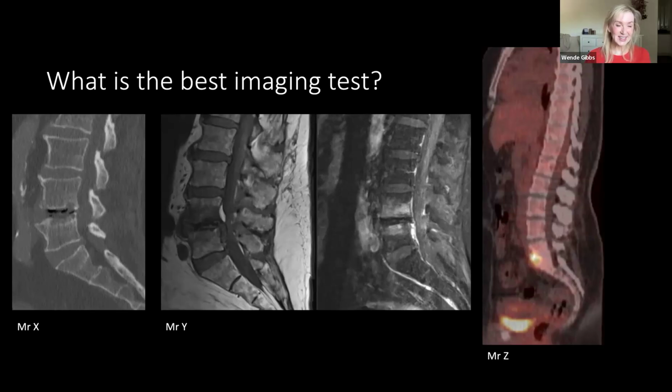On this first patient, that's different from the other two patients. This look is very suspicious to me. This isn't a typical degenerative look. There is probably a Schmorl's node here, but this pattern of demineralization just looks a little strange. I'd be suspicious, and if they asked me to biopsy that, I would.